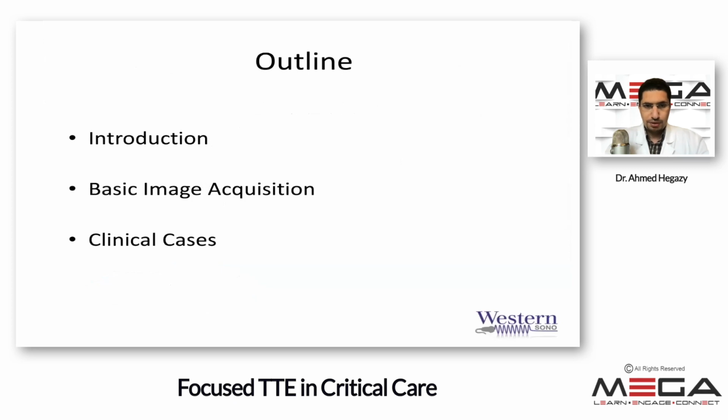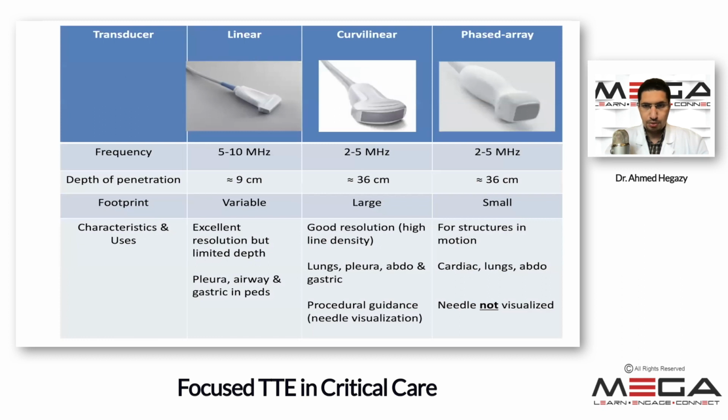All right, we'll move on. Basic image acquisition. This should hopefully be a review for some, maybe it's new for others, but I'll quickly go through the basic image acquisition steps.